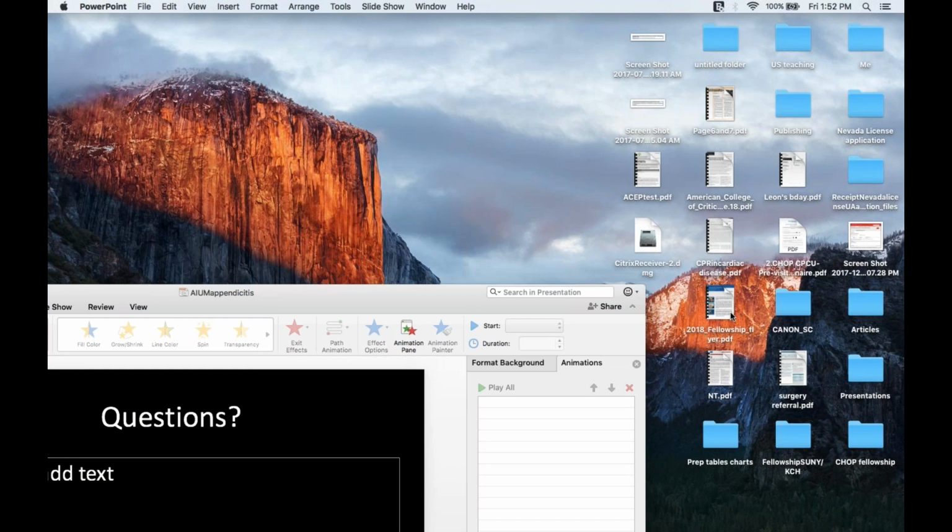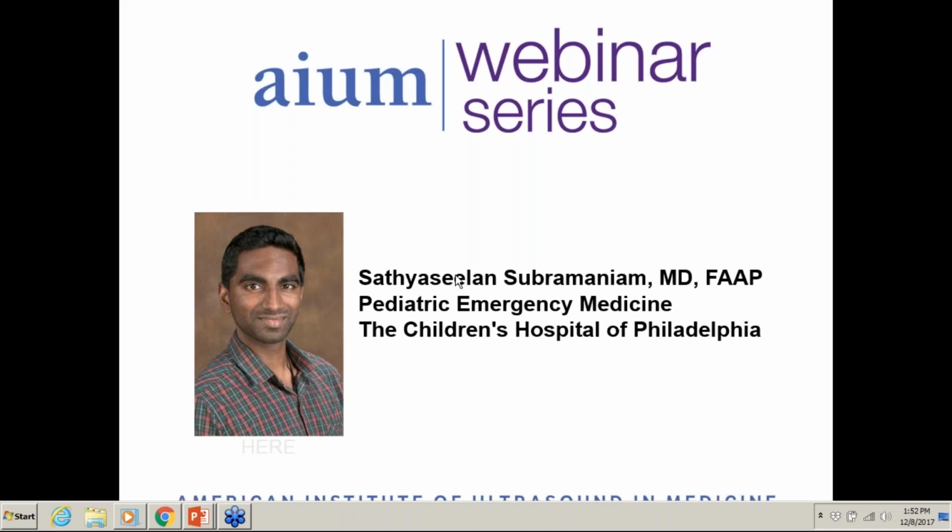Is a retrocecal appendicitis diagnosable with the ultrasound? I think in very experienced hands, this is definitely possible. There are methods where you, just like you are palpating, for example, in flank pain, you slide your hand posteriorly. You can do that closer down in the right posterior part of the abdomen, and then push upwards to try to bring the retrocecal appendix out behind the cecum. So it is possible. Now that's one way of doing it.